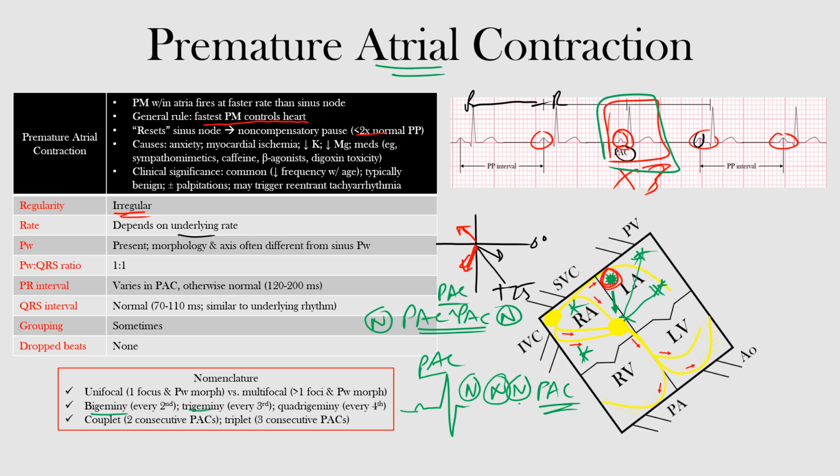Okay. So just some nomenclature that will help you, and you may hear about them, and it's just good to be aware of. Well, that's the end of this lecture. It was a longer one than we normally have, but I think there was a lot in there that you can take away that will help us as we move forward. We discussed premature atrial contraction and how it would normally appear on the EKG. I hope you learned something.